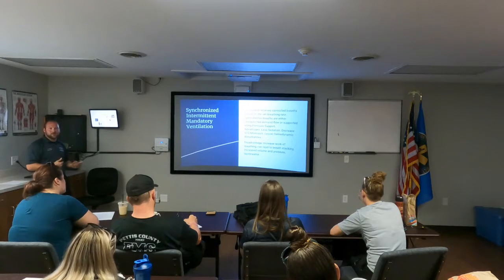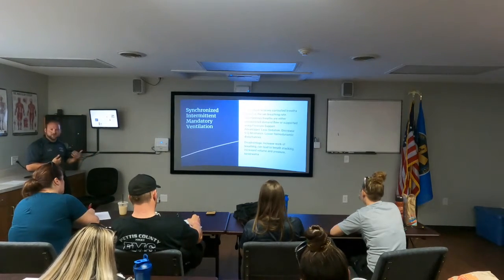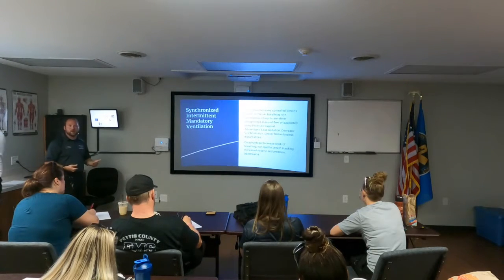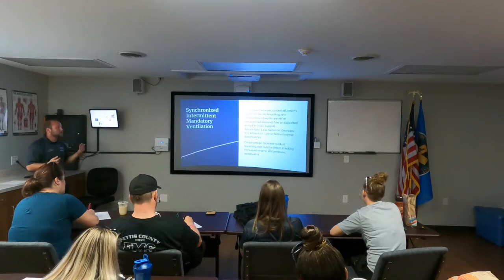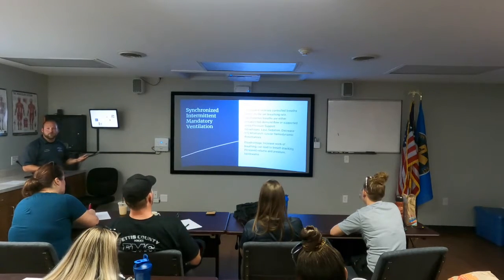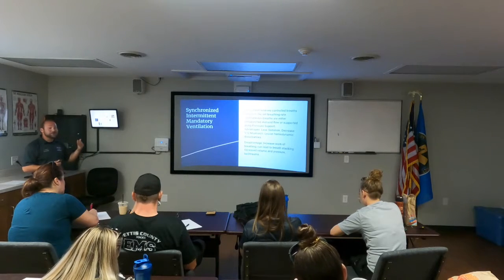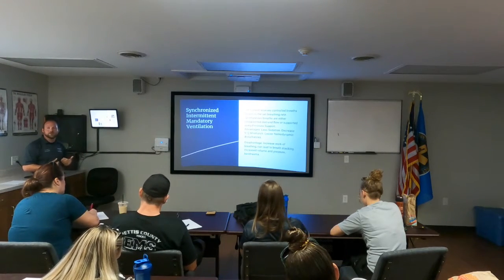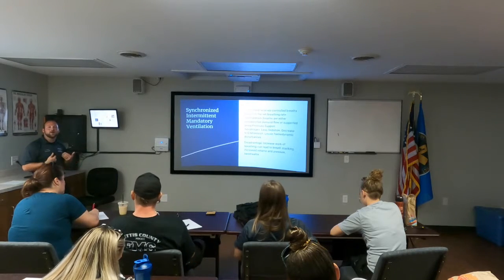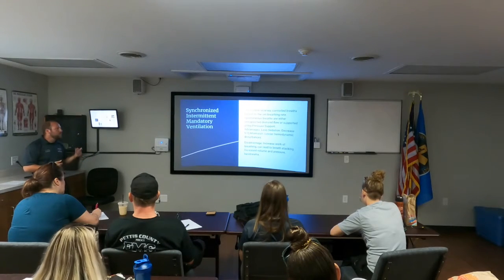If in between that 5 seconds the patient does breathe on their own, it's going to allow the patient to breathe on their own, and then it's going to reset that counter based upon that breath. That's pretty nice if they already have a pretty good respiratory drive, or they're not as significantly sedated. It allows the patient to continue having that spontaneous breathing, the diaphragm's working. These individuals probably aren't going to be on the vent for very long. That's a nice mode to have it on.